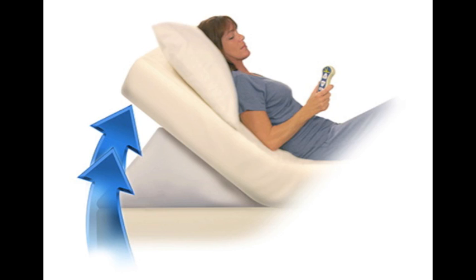Elevate the head of the bed if this is appropriate for specific clients. Consider the use of patient handling equipment such as positioning slings with ceiling lifts to avoid shear and friction when repositioning. Use products such as elbow and heel protectors to minimize contact between the skin and bed linen. Synthetic sheepskin does not reduce friction or shear.